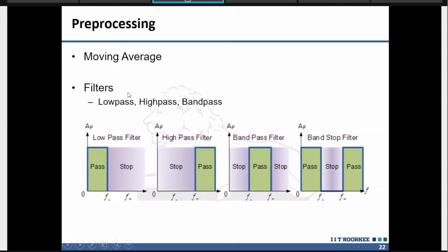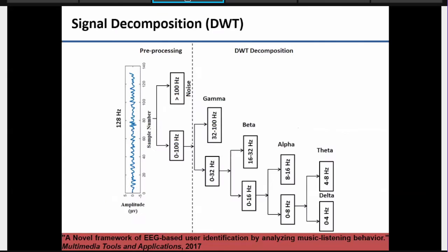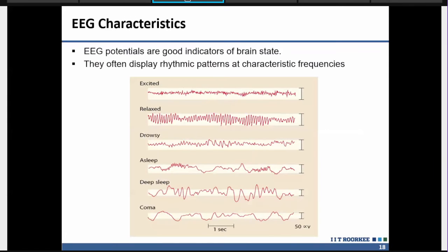So now the objective is, if we are given some signals, we have to understand what the disease is or what the severity of the disease is.